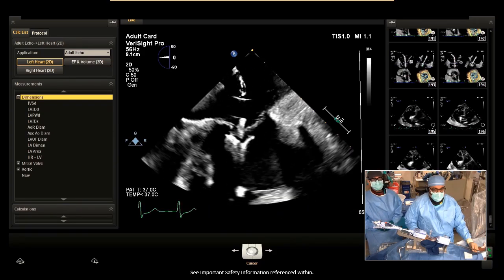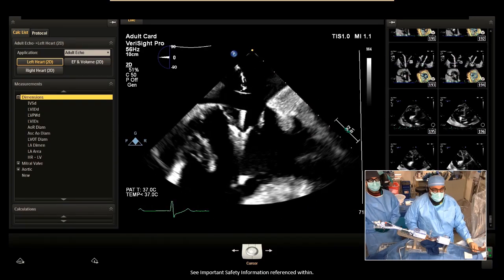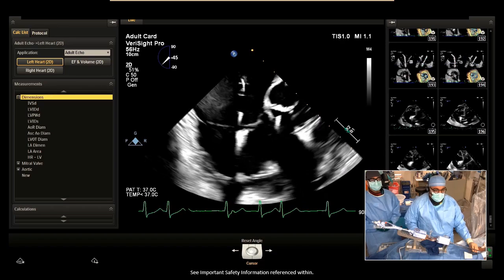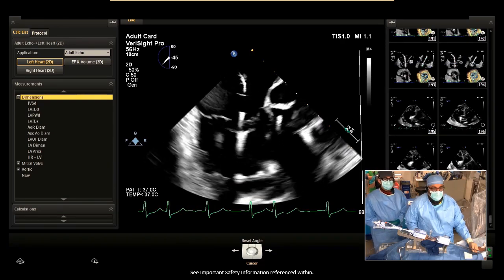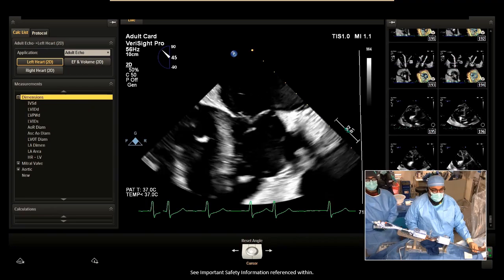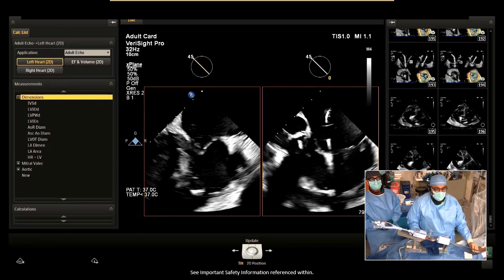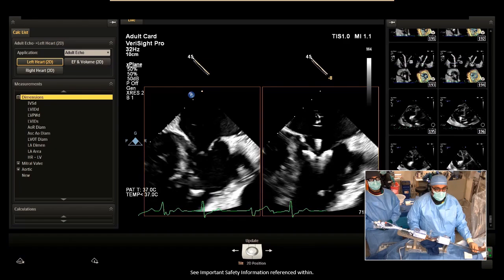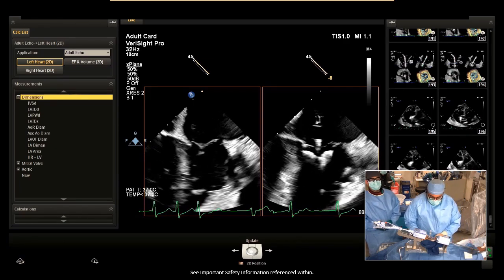So let's go ahead and, if you want to build my 3D nav map, I'll try to get this over to. This is minus 45. Okay, actually it looks like we might just be there, huh? And we already determined our plus 45 is going to be our grasping. So if you want to just X-plane first off of negative 45, Edris, I think that might be, or I guess not. Look at that.